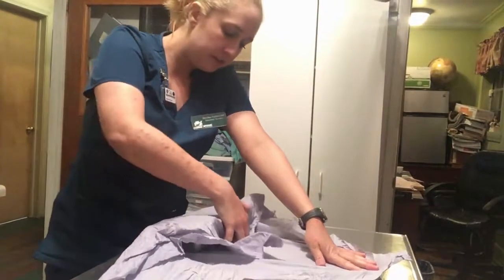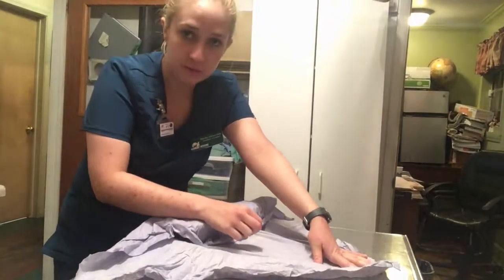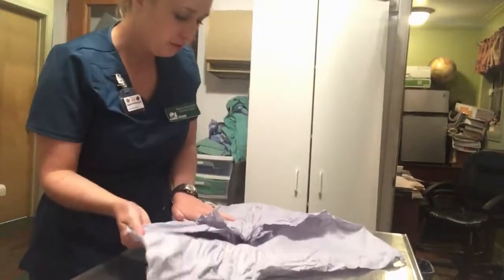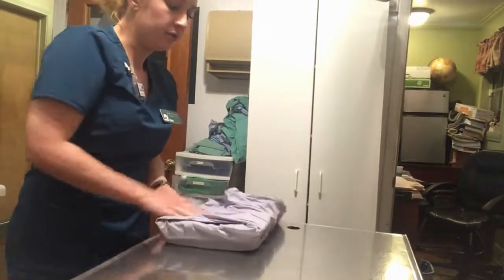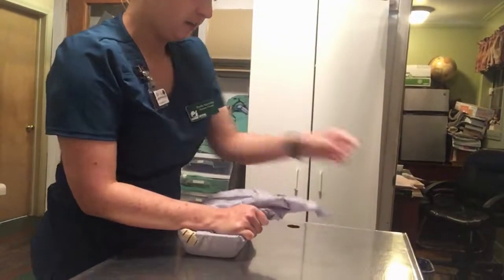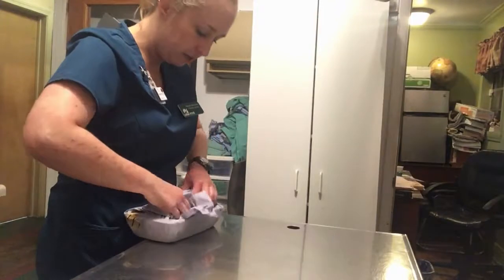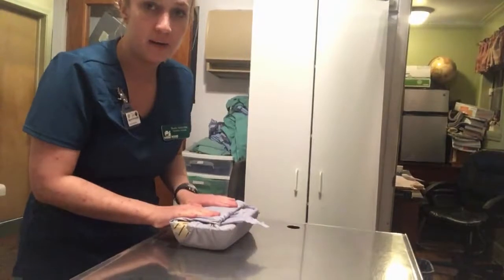And you're going to tuck this top part underneath your pack to where you have a little lip that the doctor will pull out later. Then you're going to take these sides and tightly pull them in. And you'll flip it around and take your top part, keeping it nice and flat as possible. And then you'll tuck it into those lips that you made, leaving out a little bit at top.